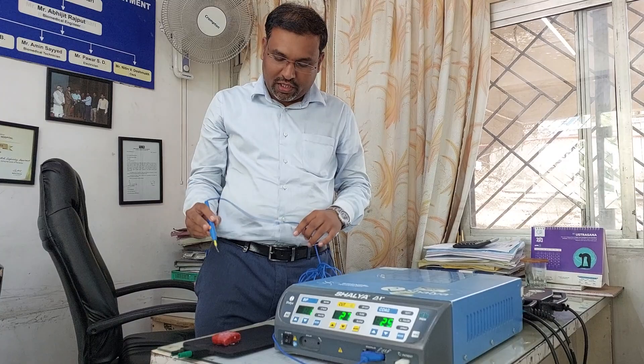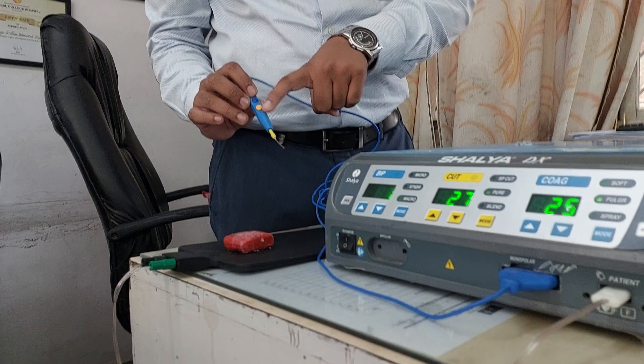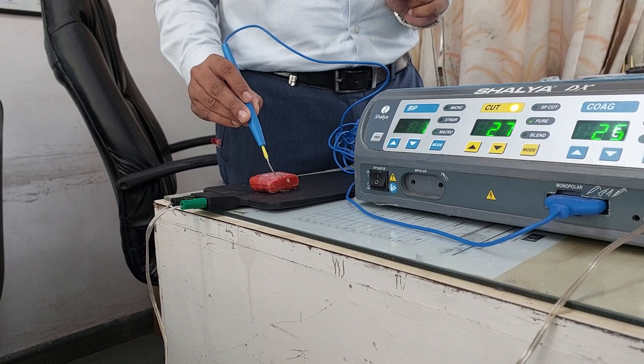To repeat: yellow is for cutting, blue is for coagulation. Now I am going to cut — just observe.